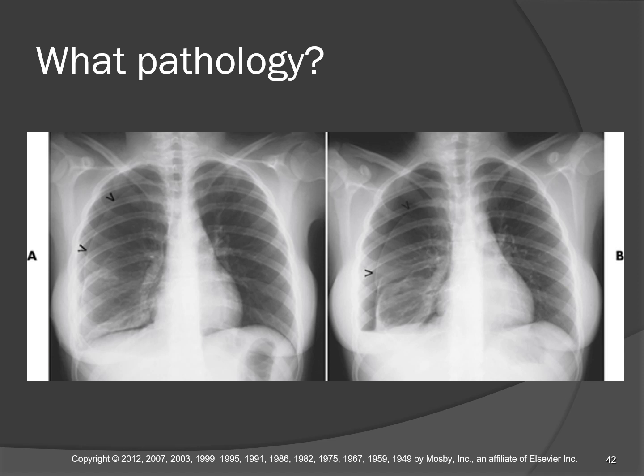So what are the black arrows indicating? The black arrows are indicating the visceral pleura membrane around the lung. Okay, it's not up against the chest wall. You're starting to amass an air volume in the pleural cavity. That's what a pneumothorax is. But atelectasis is separate from that. Atelectasis is not a synonym for pneumothorax. It's an effect of pneumothorax.